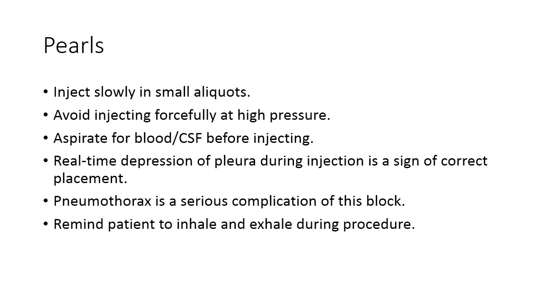Patients should be reminded to inhale and exhale during injection into the paravertebral space. Breath holding during this uncomfortable procedure can lead to syncope.